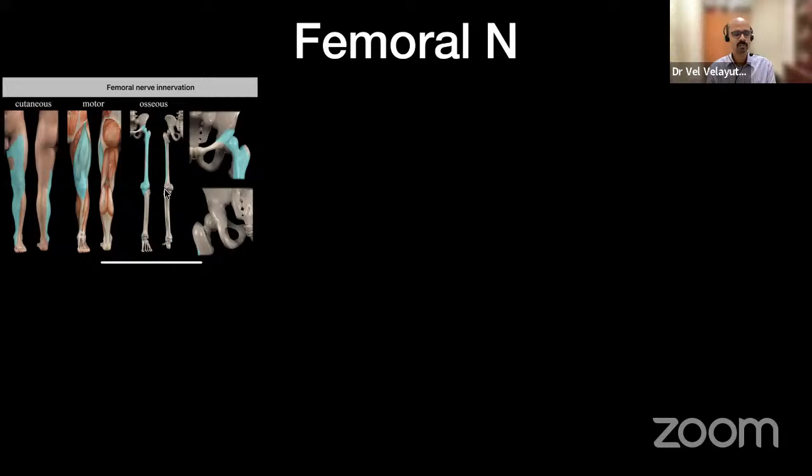So if you look at here, most of the front of the bone of the femur, especially the neck, will all be numb right down to the bottom, a little bit of the back, and in terms of the ilium, a little bit around the anterior inferior iliac spine will be numb as well. So predominantly the front of the neck of the femur, which is what you're interested in for hip fractures. So that's a good area to be numb if you want to provide relief. So this will be what's numb in a femoral nerve block.